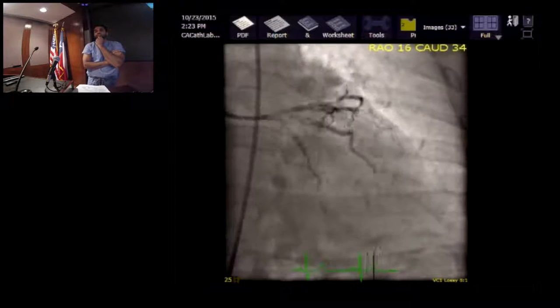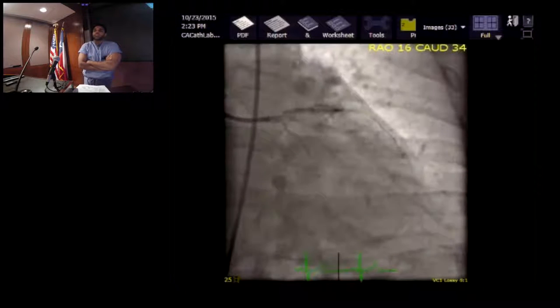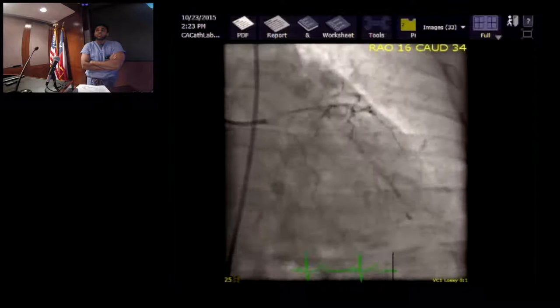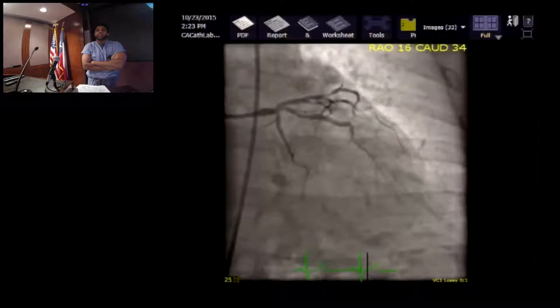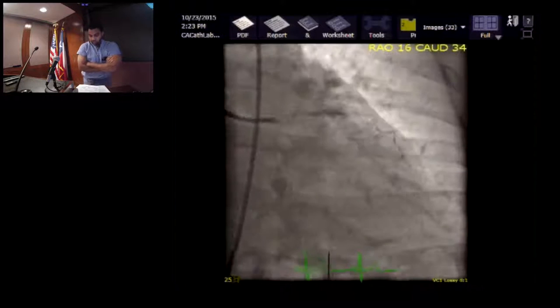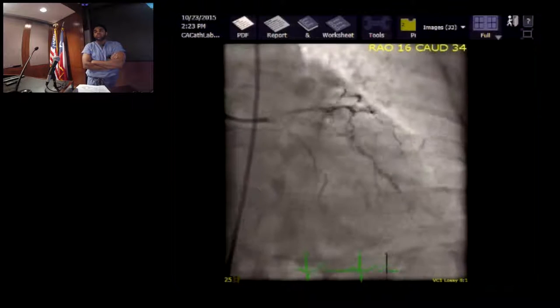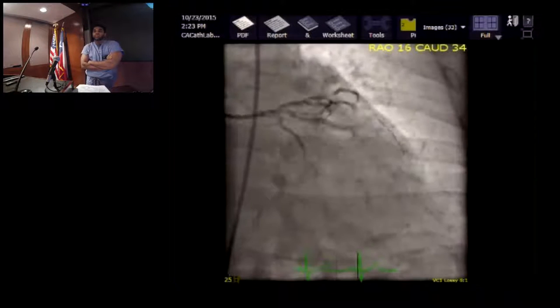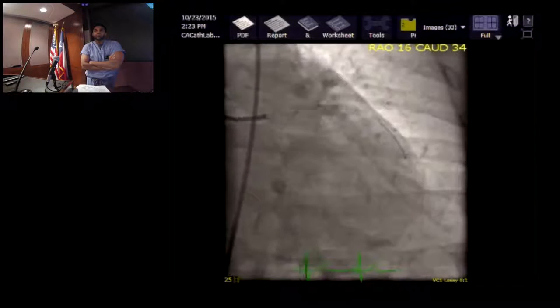We wanted to do an IVUS because for the significance of ostial and proximal vessel disease, IVUS is a very good idea to assess the disease extent. We could see quite a bit of eccentric flap, but on the IVUS the MLA, the minimal luminal area, was almost 5 millimeters squared. Yeah, they said 4.9. So that would be non-significant as well. What would be your cutoff for significant based on IVUS? So 4 millimeters squared for a branch and 6 millimeters squared for the left main.